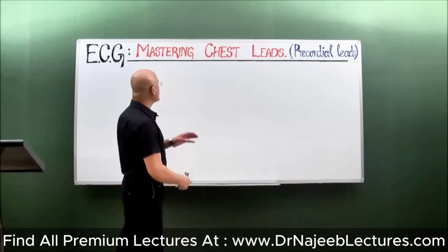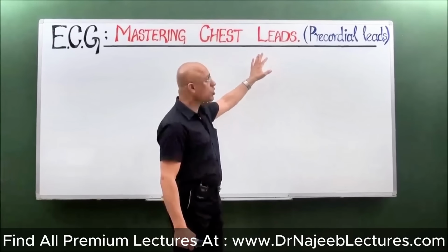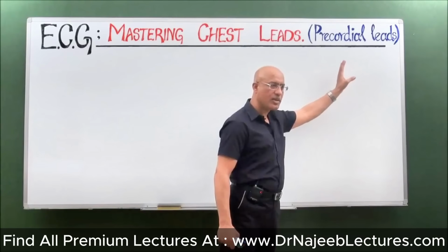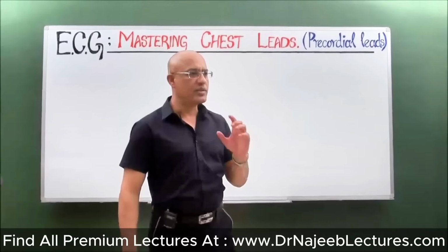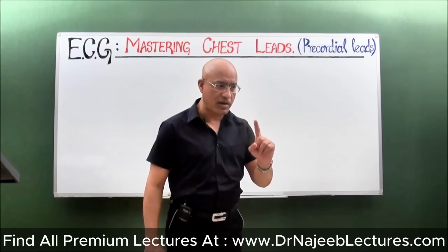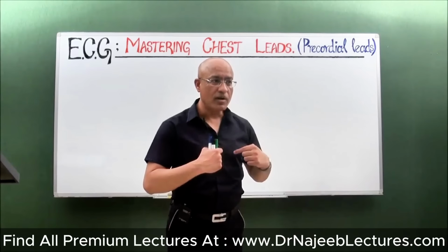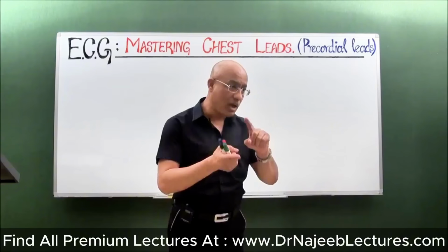Now, today we are going to talk about chest leads, which are also called precordial ECG leads. What is the special thing about the chest leads? Chest leads basically determine the electrical activity of the heart transmitted along the horizontal plane.